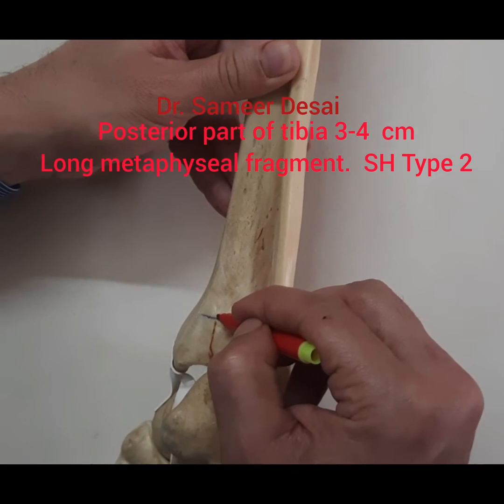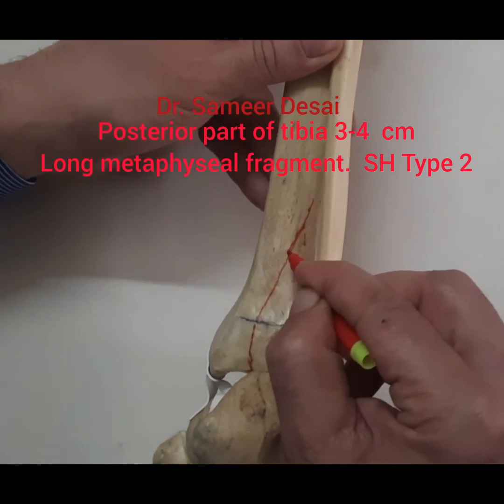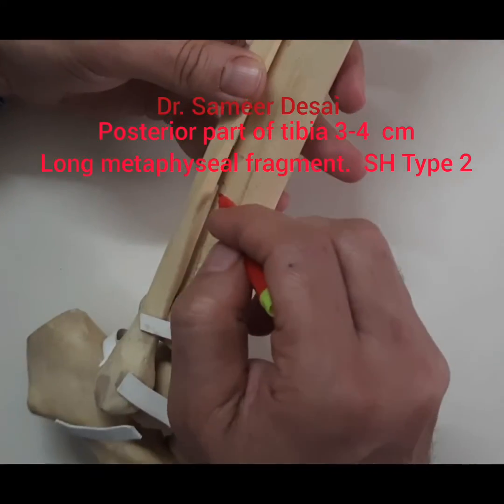Then mark the posterior part of the tibia — about 3 to 4 cm long metaphyseal fragment, which is a Salter-Harris type 2.